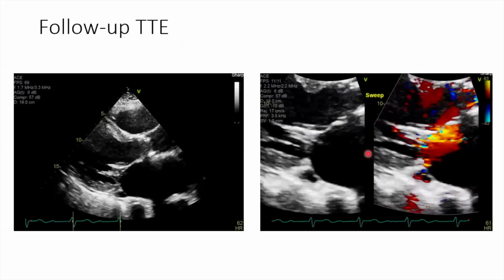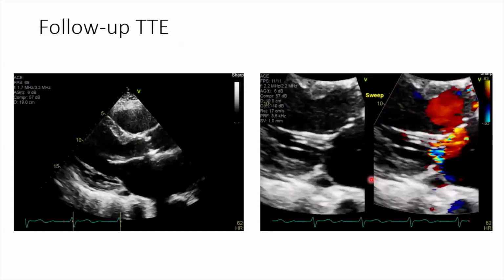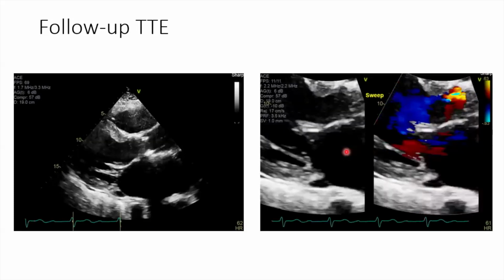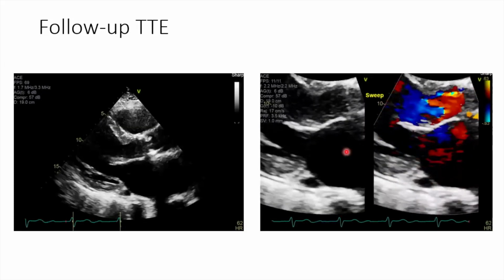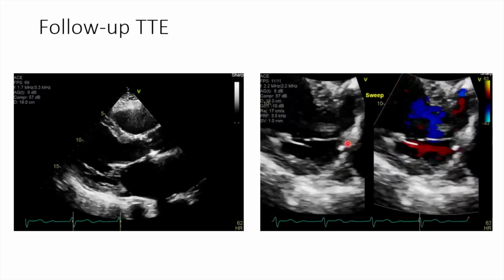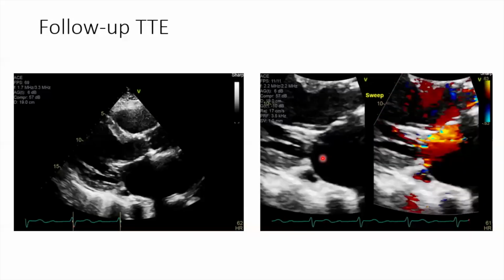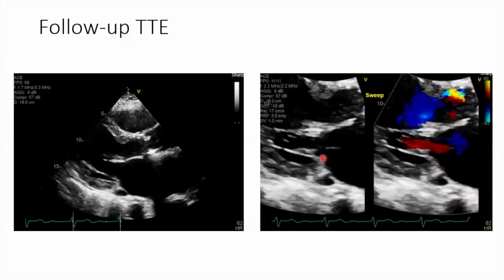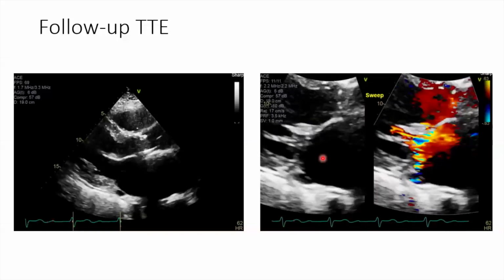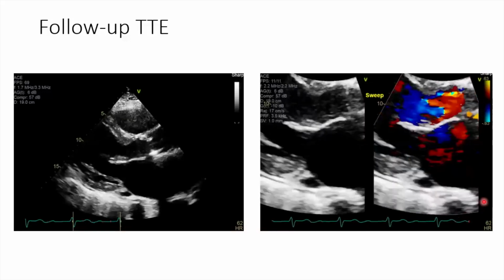Now we can see, these are the parasternal long axis images. You can see on this zoomed up view, towards the very end of the clip where they're sweeping more medially, you start to see this mobile segment. As I mentioned, there was the question of a torn cord, but there also looks to be a flail segment of the posterior leaflet as well. I'm not sure if that's towards the very end of the clip, that perhaps the posterior leaflet has residual prolapse and flail.